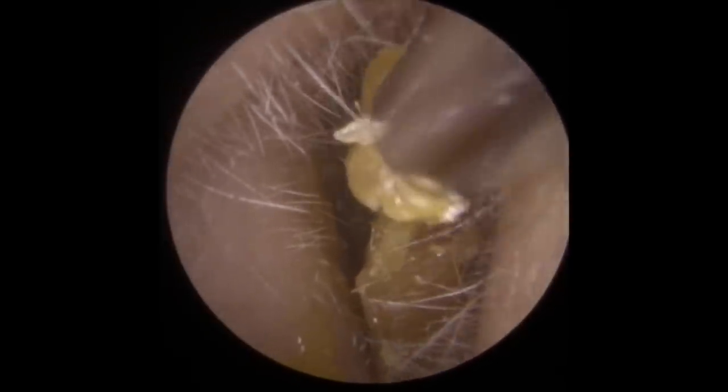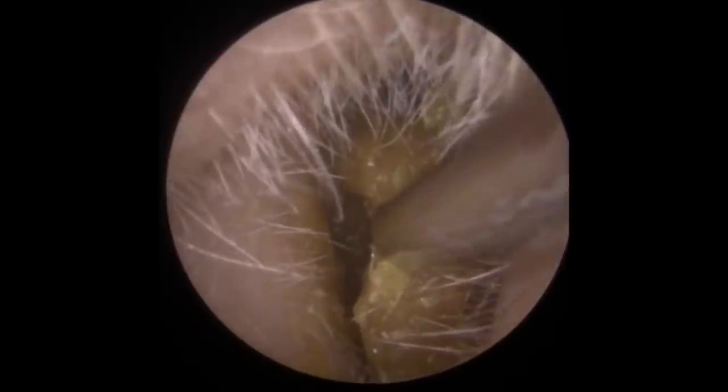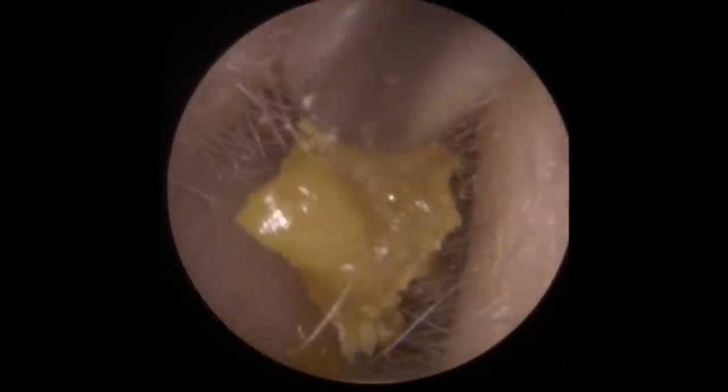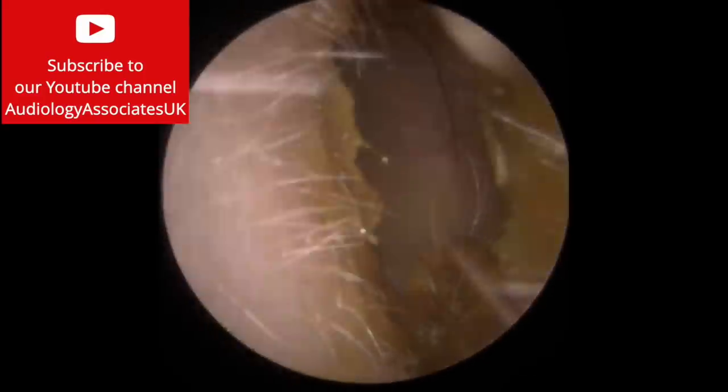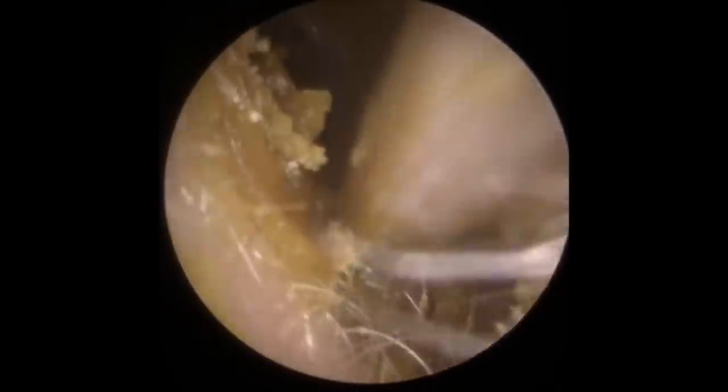What we can see here is a dry piece of wax just lodged in the ear canal. You can see how the ear canal isn't quite that normal circular shape - you've got more of an oval shape, so quite a thin ear canal. Just trying to get a grip on this dry wax here. There we go - you can see that was lodged perfectly into the shape of the canal. So that wax is gone, we've actually cleared the offending wax from the canal, and just doing a little bit of tidying up now at the entrance.